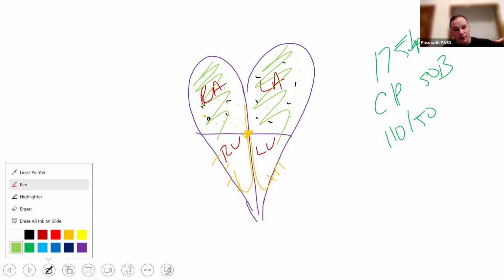Now I just put a ton of clots into circulation, right? I just put a ton of clots into their lungs. I just put a ton of clots all throughout their body. So that's my personal big concern with synchronized cardioverting every AFib with RVR patient that I have, okay, which fortunately doesn't happen that often. But if you do have this type of patient, if nothing else, I want you to stop and think, man, should I really synchronize cardiovert this patient?